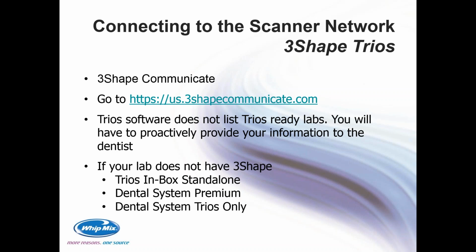It can be set up in the Trios system to where once they have completed the scan, very simple, one or two clicks, and they can send the file straight to you, or just pick your lab right there in the drop-down box. But it is one they have to add.